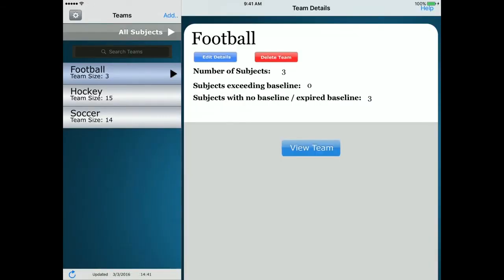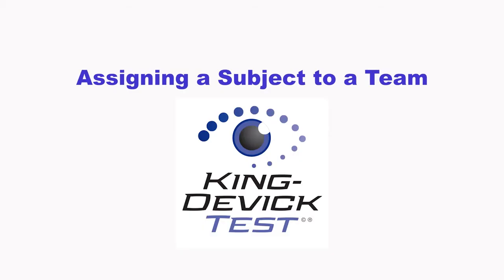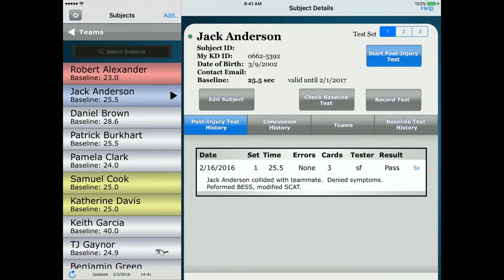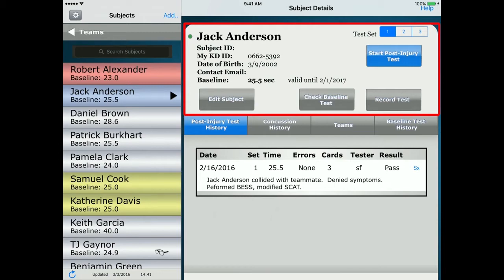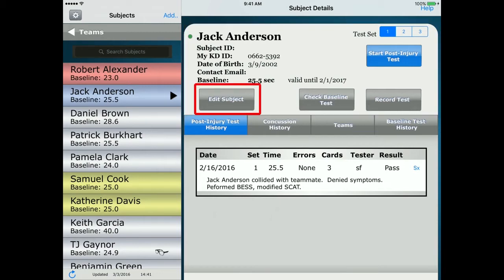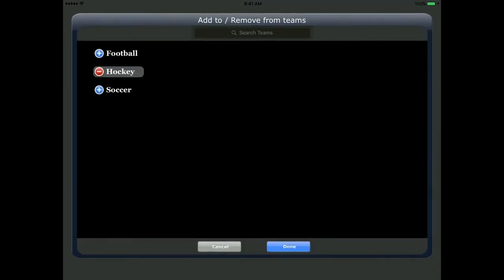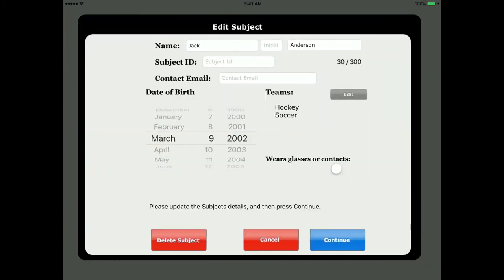Tap Edit Details to change the team name or add/remove subjects. You can organize your existing subjects into teams — this function is available to account administrators and users with access to all subjects. Select the subject from the subject list on the left column, tap Edit Subject, then under Teams tap Edit. Add the subject to the desired team, click Done, and press Continue when complete.